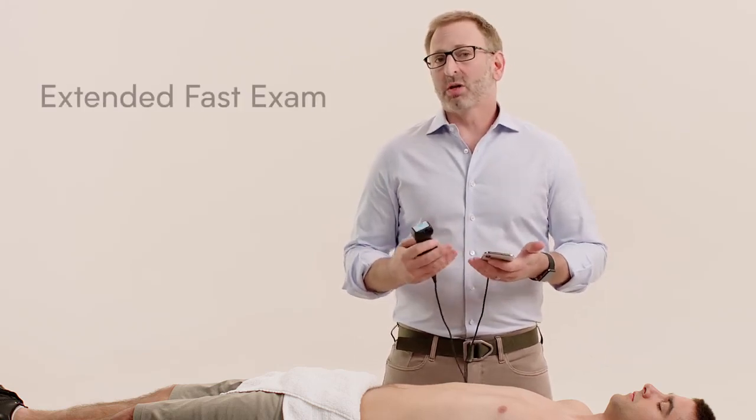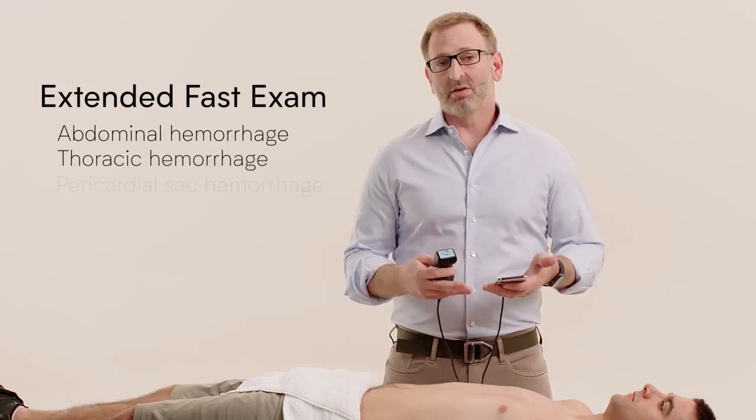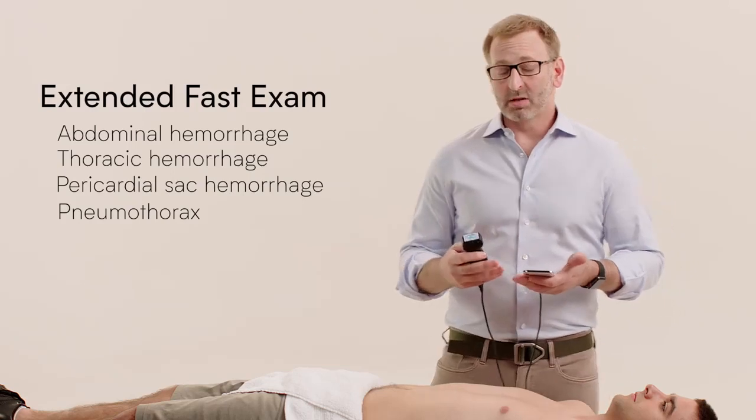In trauma patients, we're concerned about hemorrhage, and we're concerned about hemorrhage in the abdominal cavity, into the thoracic cavity, into the pericardial sac surrounding the heart, or lung collapse or pneumothorax.